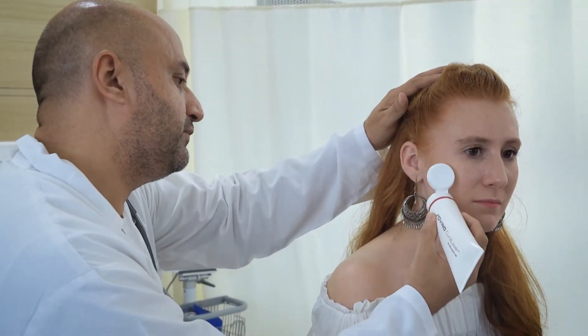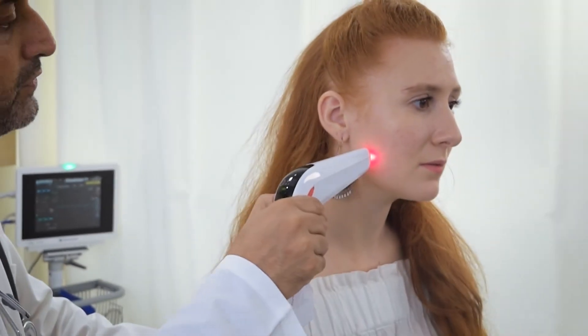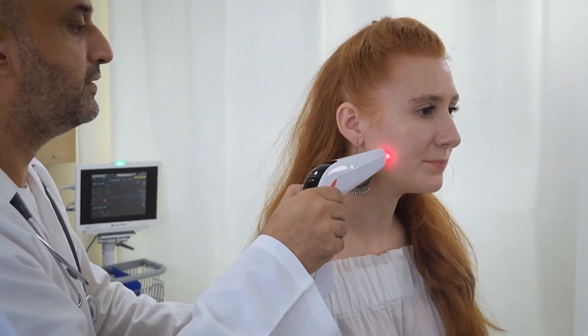Apply a small amount of Cura Laser biostimulation gel either on the therapeutic head or over the jaw. Press the small switch to turn on the small therapeutic head, and hold Cura Laser as demonstrated.